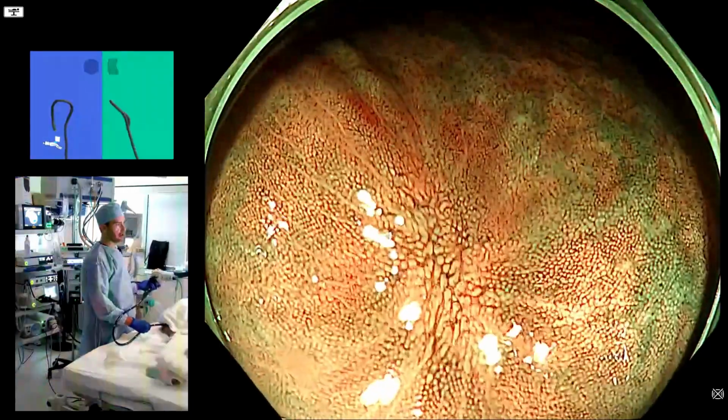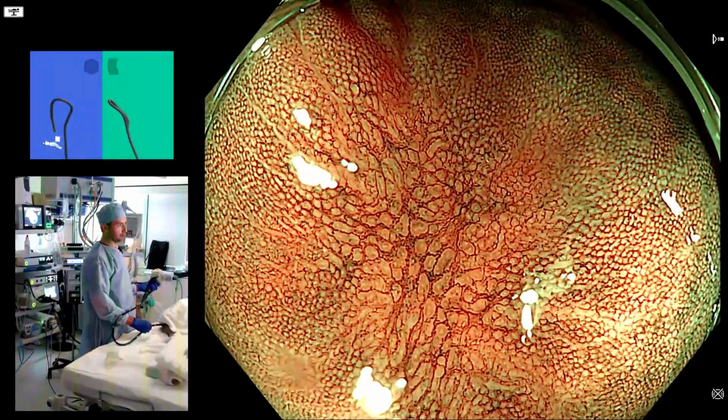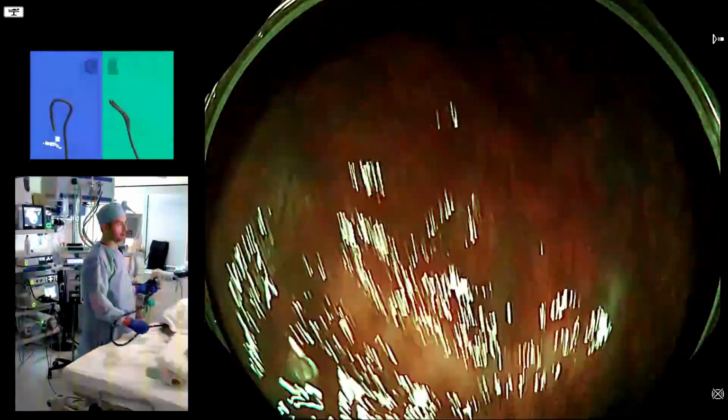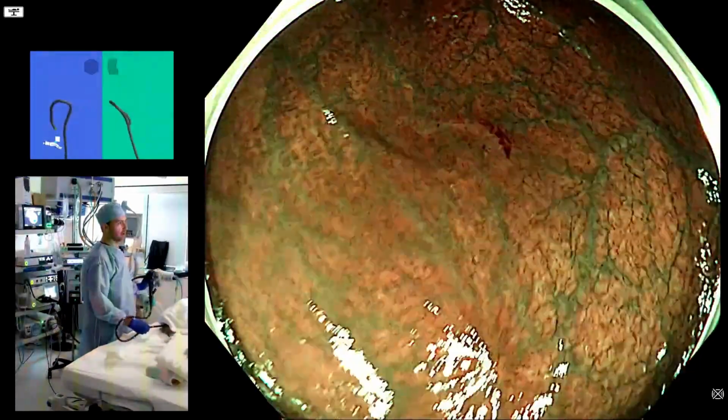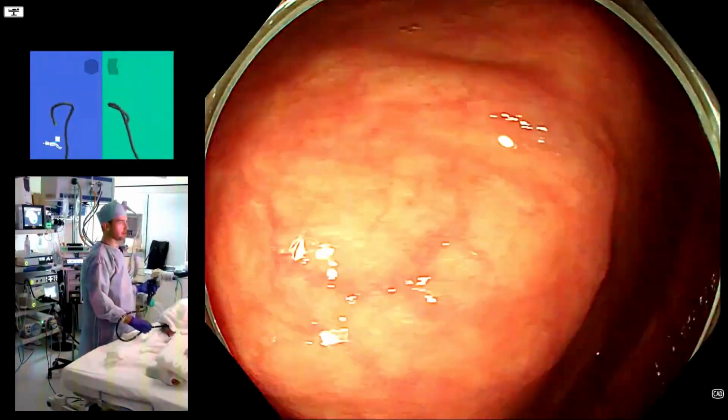The human intelligence mode would be to switch on narrowband imaging, get close up, really analyze the vascular pattern and pause. And I see no recurrence there either. So both human and AI agree on that. But AI is not currently trained on those images of virtual chromoendoscopy.